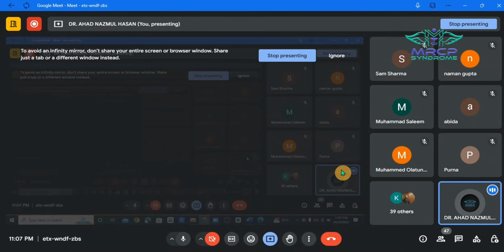But in case of acute hemorrhagic stroke, the CT scan is gold standard, and this is more sensitive compared to the MRI. And also in case of trauma, you can go for a CT if this is an acute emergency condition. And in case of hydrocephalus, we can go for the MRI as well as the CT scan. And the CT scan with contrast is usually indicated in case of tumor as well as infection and abscess. So what are the limitations of CT scan?